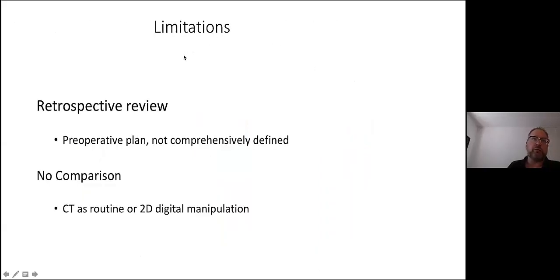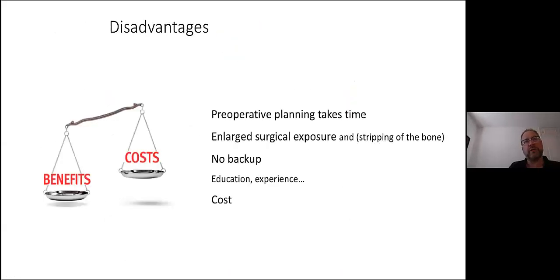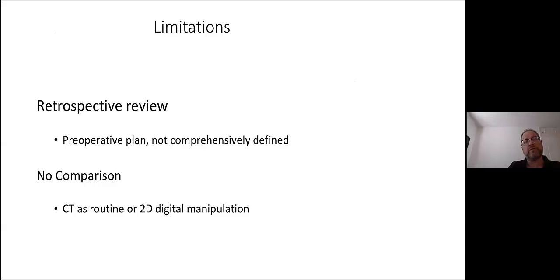So, there should be a slide here about the results. But anyway, 15 of the 23, or was it 17? Anyway, it was more than in 50% of the cases we did a radical change in our original plans. So the planning made a lot of difference. The guide is good in the surgery, of course, but the change of surgical procedure, I think, is the planning.